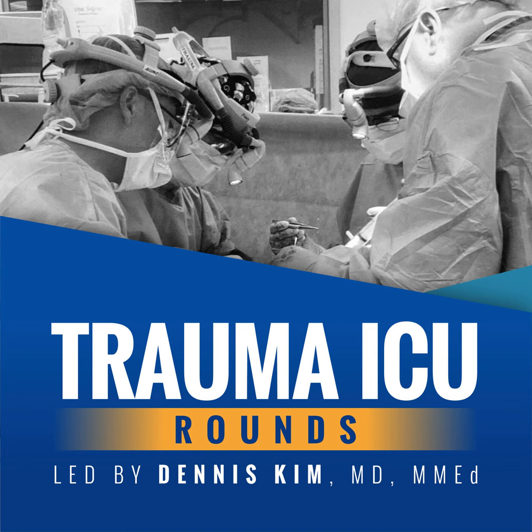What's the first thing we should do? If you answer dial down the tidal volume, then you're absolutely correct. And this is, of course, in addition to the other targets we want to be meeting, including judicious or liberal use of PEEP, permissive hypercapnia, and my favorite, restricted fluids. Now, while we continue on the topic of pressures, it probably makes a lot of sense to discuss two more important pressures. Those are the peak airway or inspiratory pressure. And this is the highest pressure measured during inspiration, during volume control ventilation.